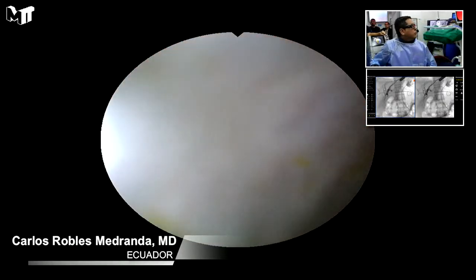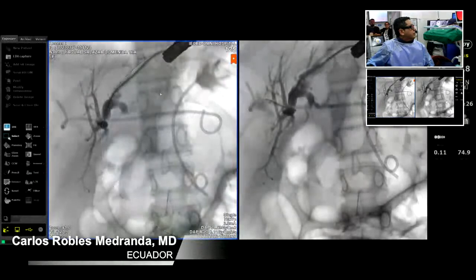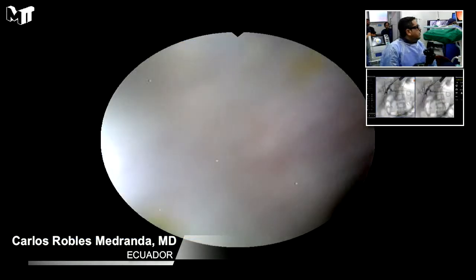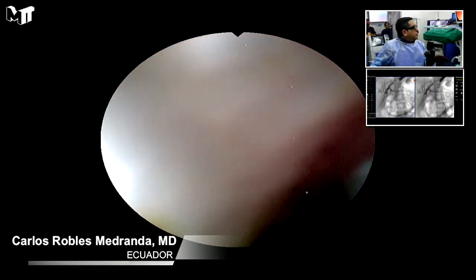You see? Now I pass. Very good. So I will pass here. It's not easy, huh? I need to push more my guide wire.